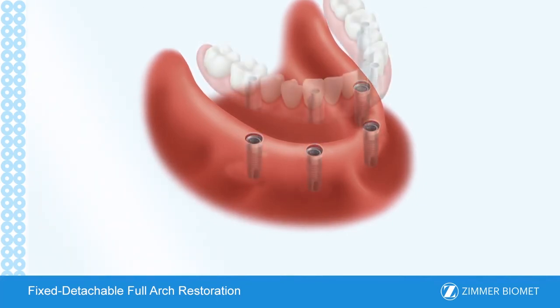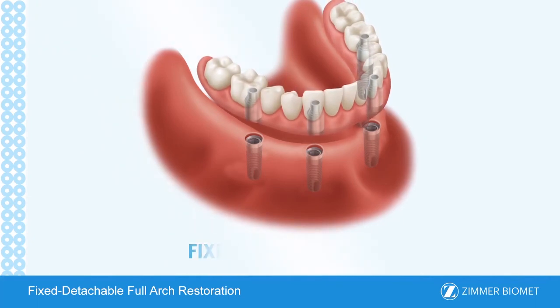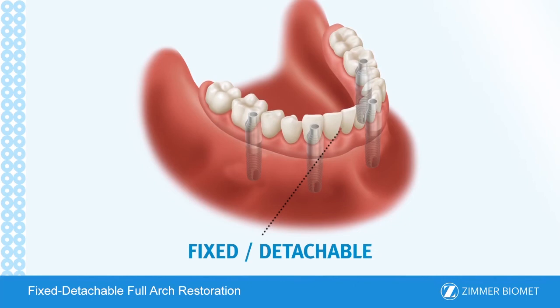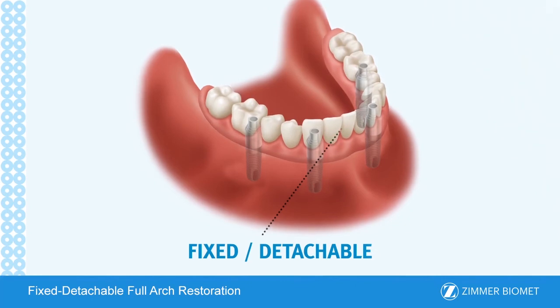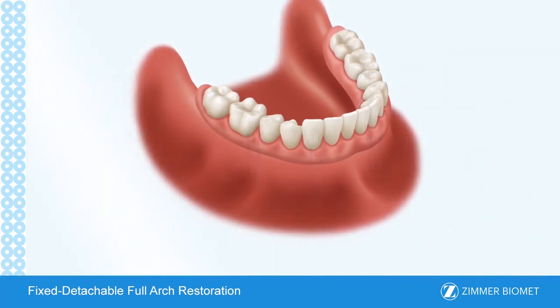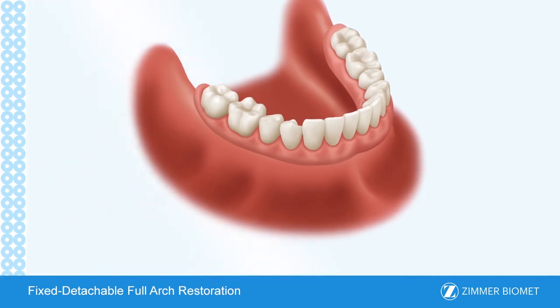Following healing, the implants are uncovered and a custom fixed-detachable full-arch restoration, manufactured by a dental laboratory, is seated directly into the implants. Using small screws, the restoration is then secured to the implant bodies. This keeps the restoration stable and stationary, while enabling your dental practitioner to remove it should the need arise. If you are missing all of your teeth in either your upper or lower jaw, or in both jaws, a fixed detachable restoration may be the best solution for you.